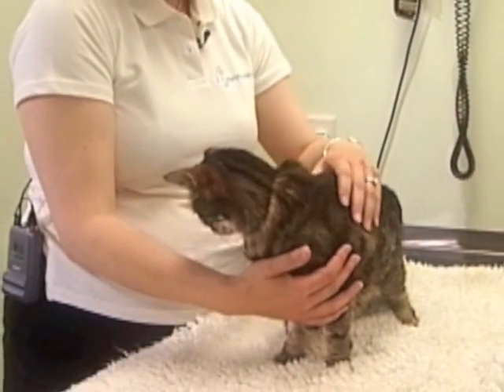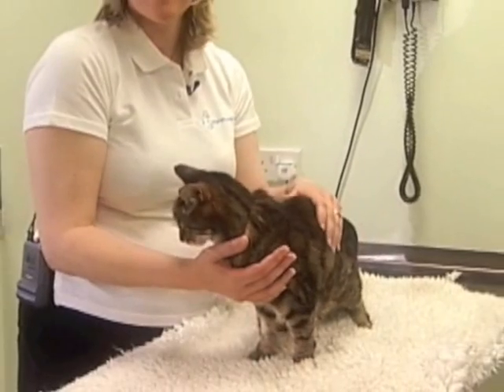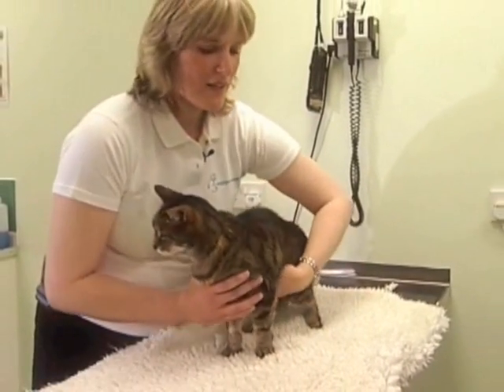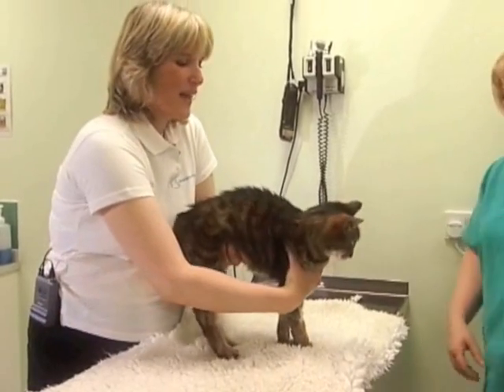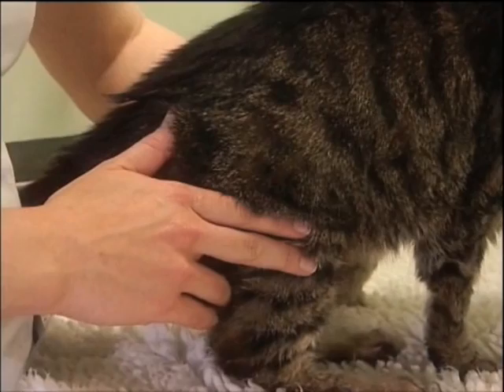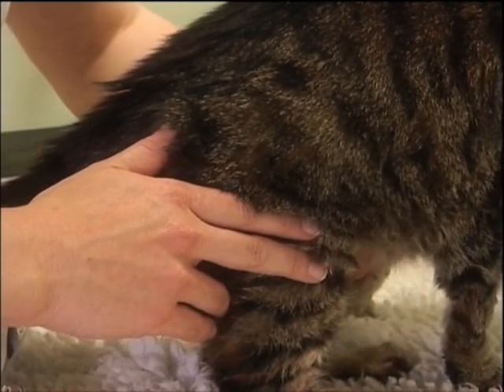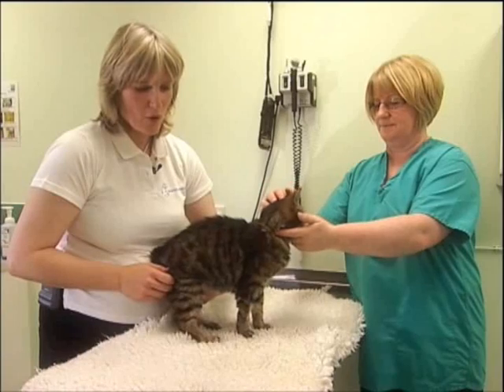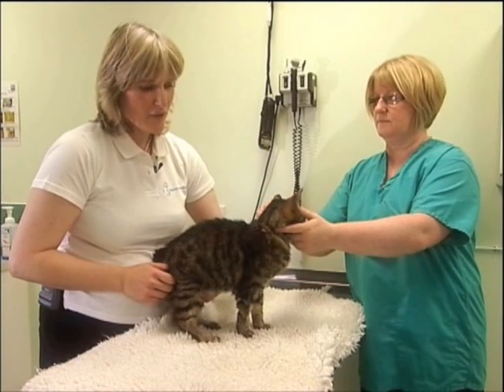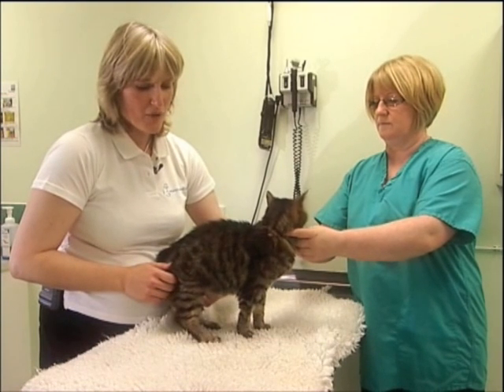In general, the quickest and easiest way to get a urine sample from a cat is to do a procedure called cystocentesis. To do that, the first step is to make sure that you can palpate the cat's bladder. If you can't palpate the cat's bladder, then you shouldn't stick a needle into the abdomen. If you find — either because the cat's very fat or because the bladder's very small — that you can't palpate it, then an alternative is to use ultrasound to guide placement of your needle.